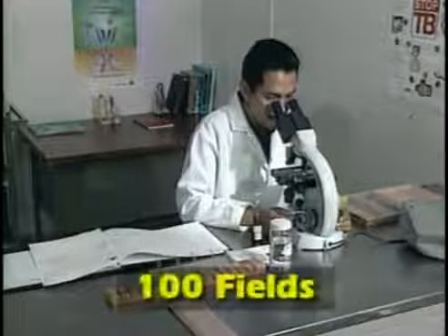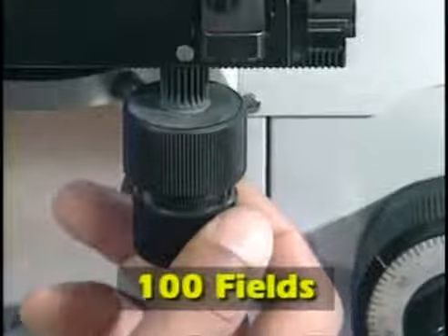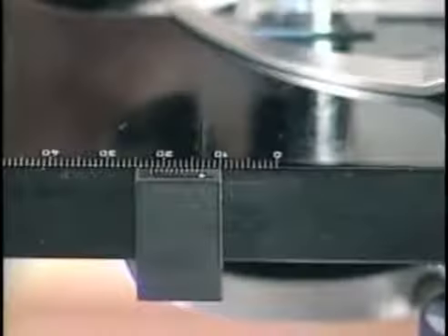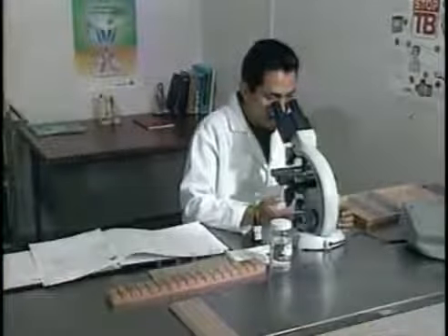At least 100 microscopic fields should be examined before reporting as a negative smear. Examining fewer than 100 fields may cause a false negative report. Fewer than 100 fields can be read if the slide is positive for AFB. Read systematically to avoid overlap, moving the slide lengthwise so that the next field to the right can then be examined.